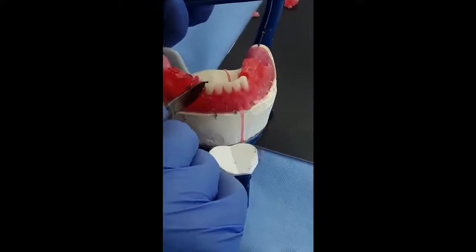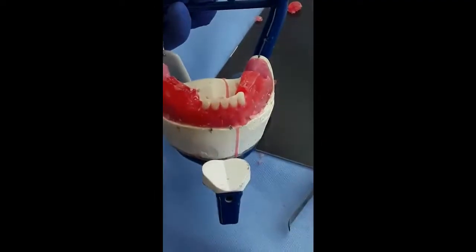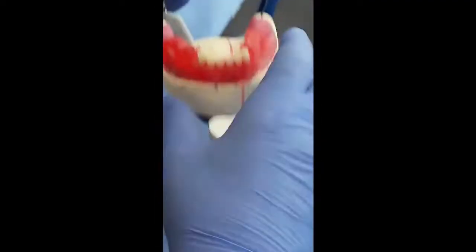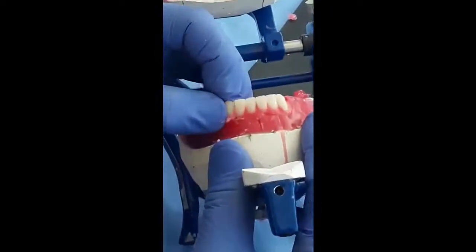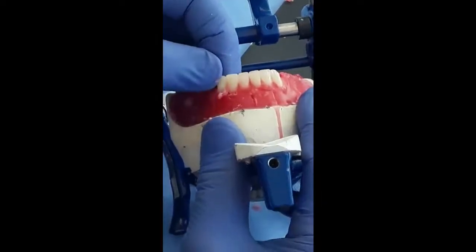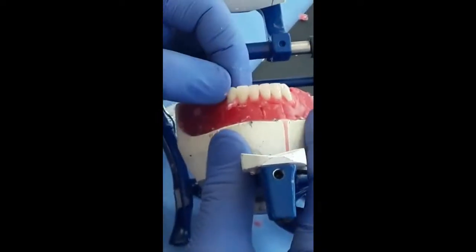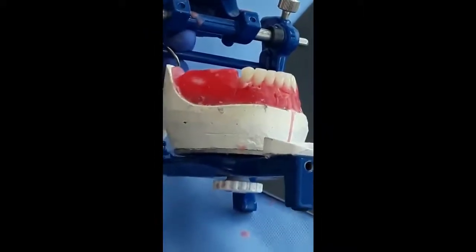What do we need to achieve? The last tooth of the lower anteriors, the lower right canine, I put it so the neck is prominent and the long axis goes more distally than the lateral.